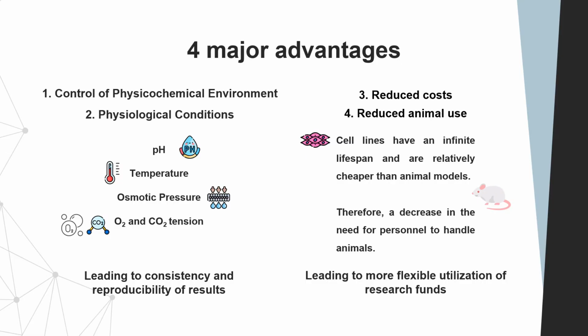Okay, so you have standardized protocols for cell culture techniques that allow researchers to always handle the cells and maintain the cells in a very consistent manner, hence minimizing variability and also enhancing the reliability of all the experimental outcomes. And this reproducibility is very important, because it is really needed to validate scientific findings and also to advance research in many different fields.